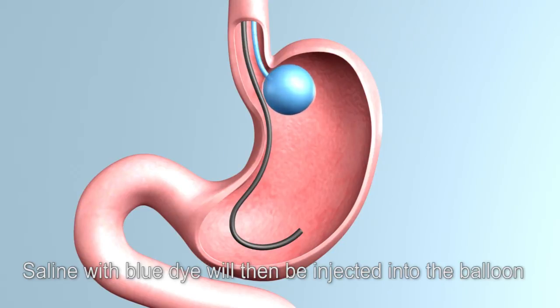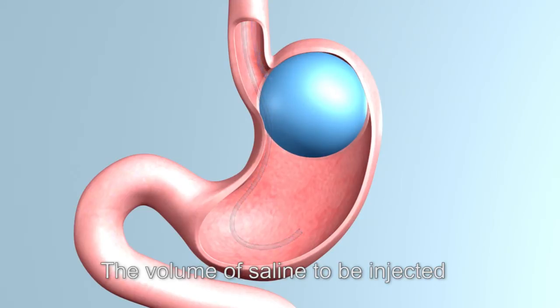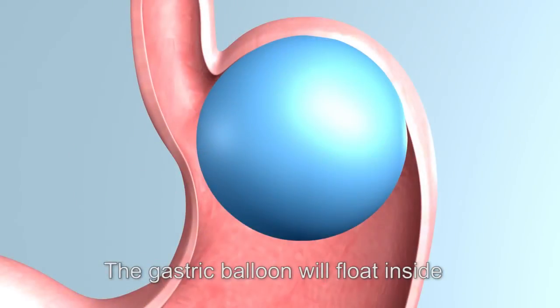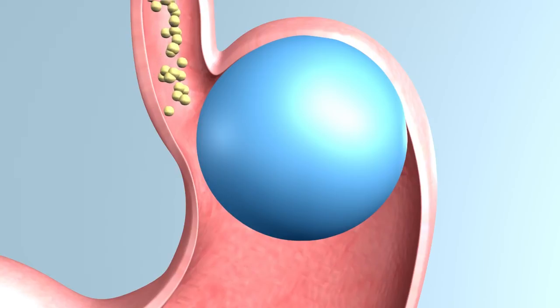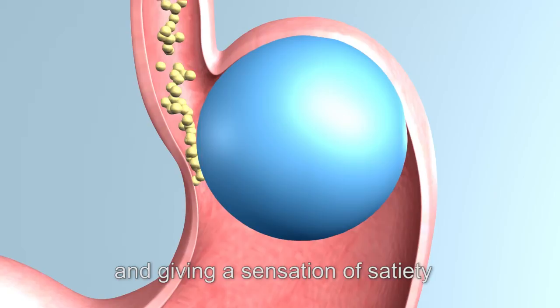Saline with blue dye will then be injected into the balloon via a catheter to increase its size. The volume of saline to be injected depends on the individual's conditions. The gastric balloon will float inside the top of the stomach, effectively reducing stomach volume and giving a sensation of satiety.